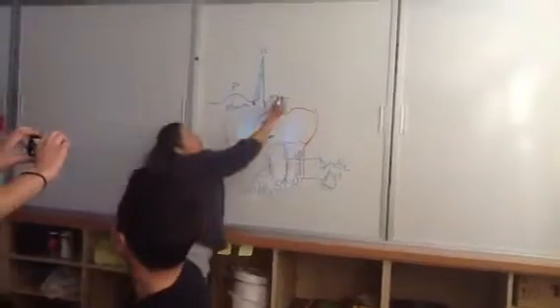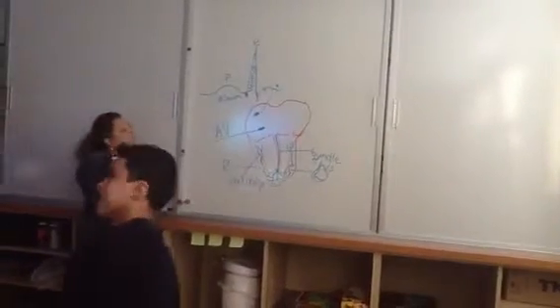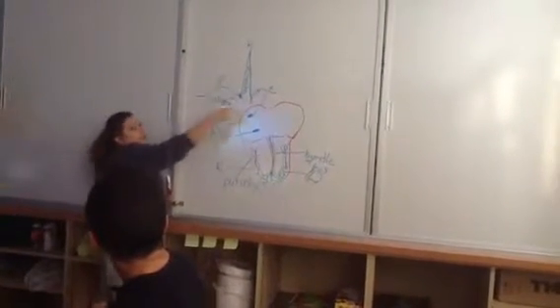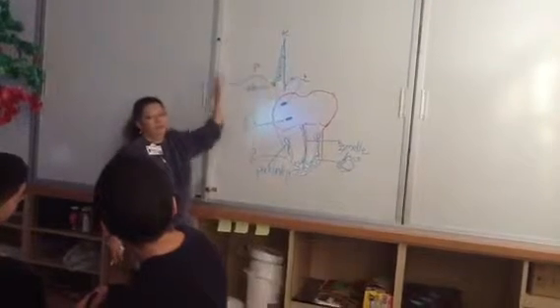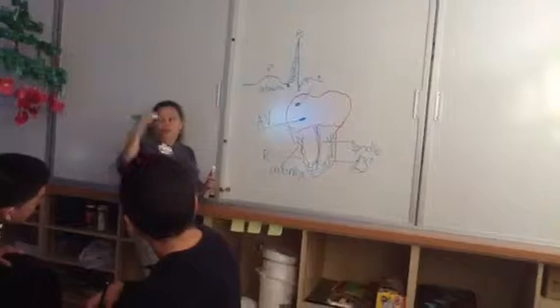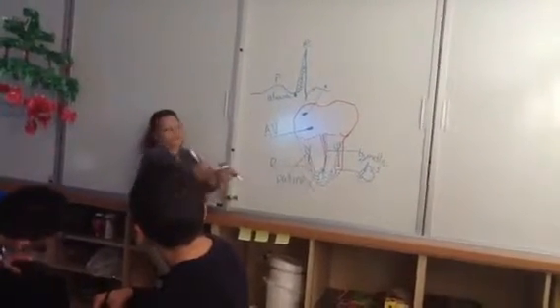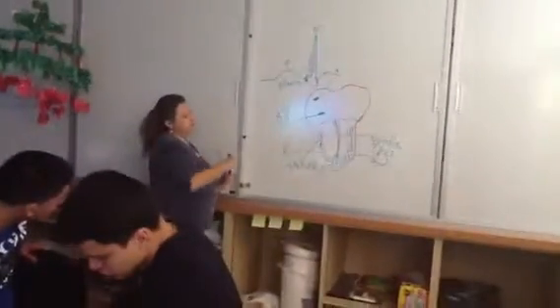Okay, so that's a U wave, and it may not be obvious in some of the EKGs. Then it'll start back again, isoelectric, and then the atrium will contract, which it does in seconds. So when you do CPR, you get 5 cycles, and it's done this a bunch of times already by the time you do a cycle. That's why they figured out if you do chest compressions, it starts contracting, so it's a lot better.